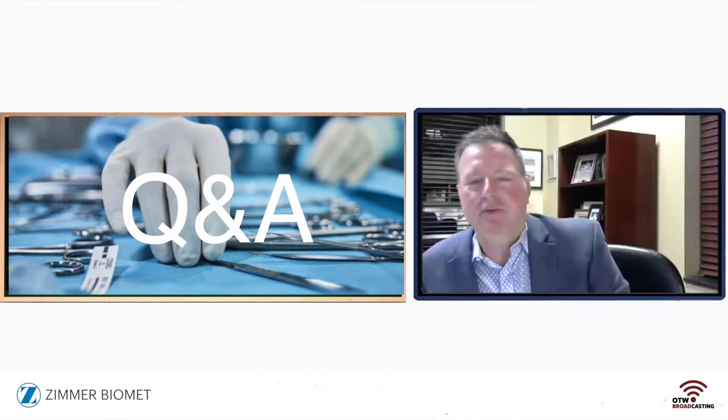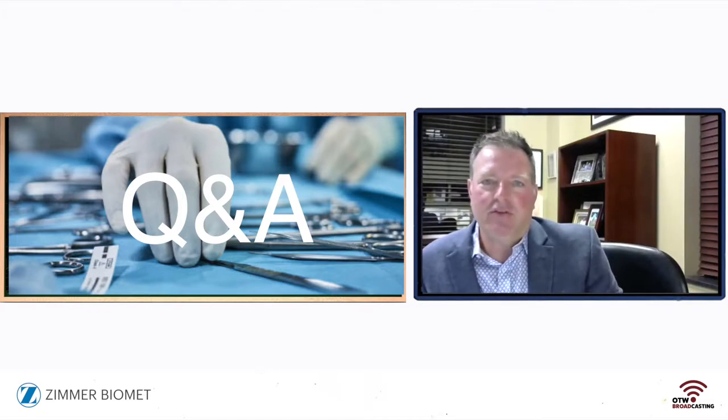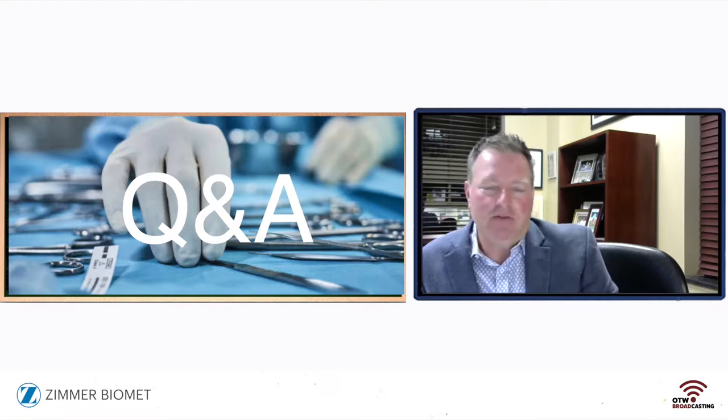Well, I'd have to certainly echo what Amar has shared with you guys. The preservation of motion is so important and so much greater when we can perform a VBT procedure instead of a fusion. And now we're starting to really understand what that means on the MRI studies, with the preservation of anatomy and avoiding things like adjacent segment disease.